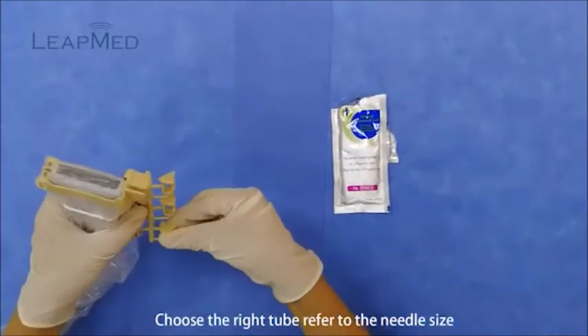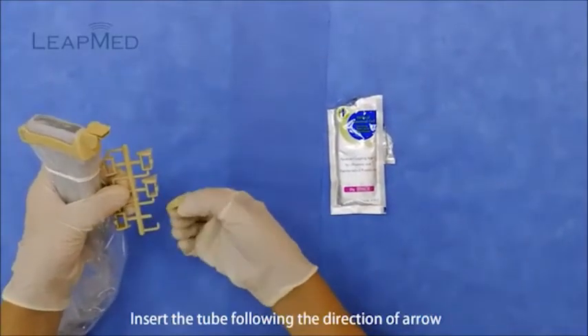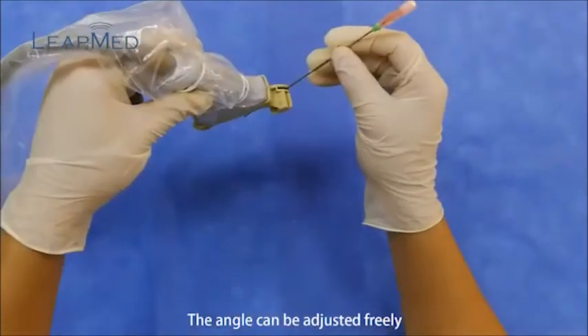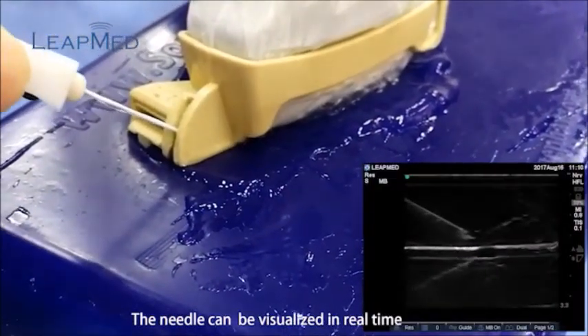Choose the right tube referring to the needle size. Insert the tube following the direction of the arrow. The angle can be adjusted freely. The needle can be visualized in real time.